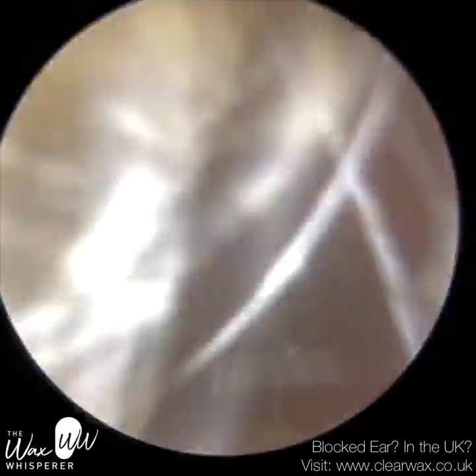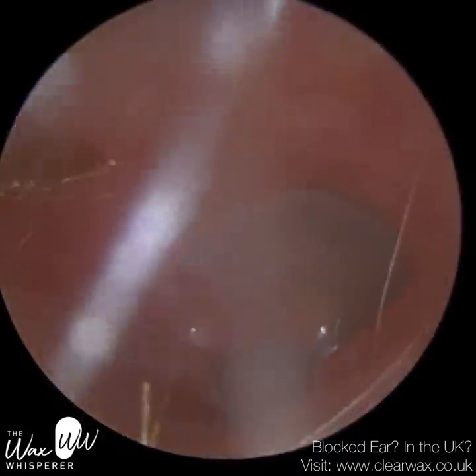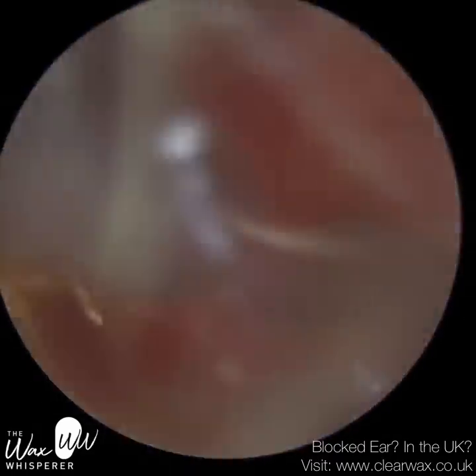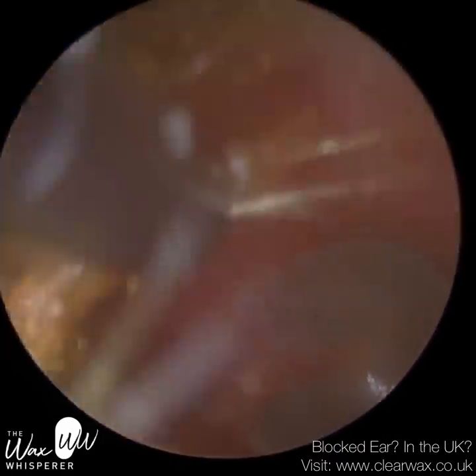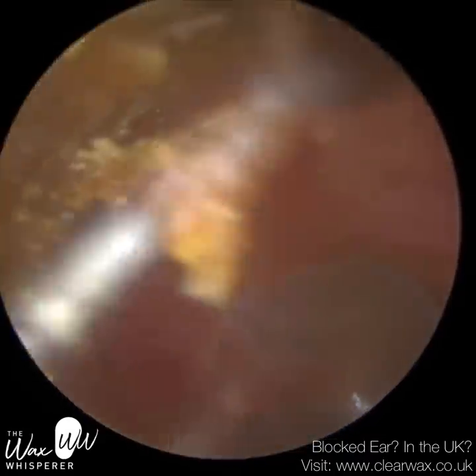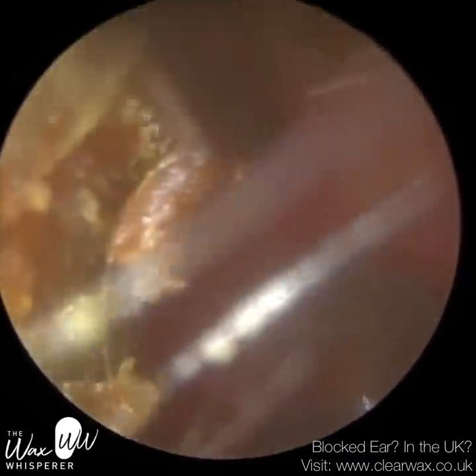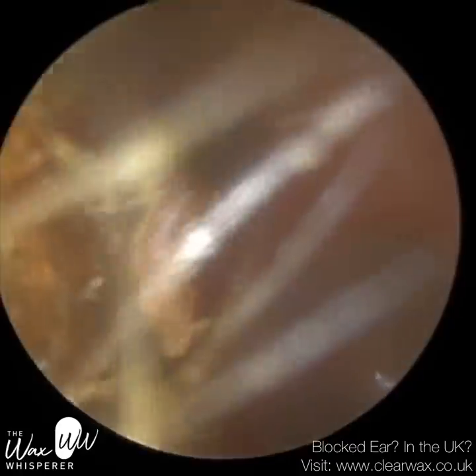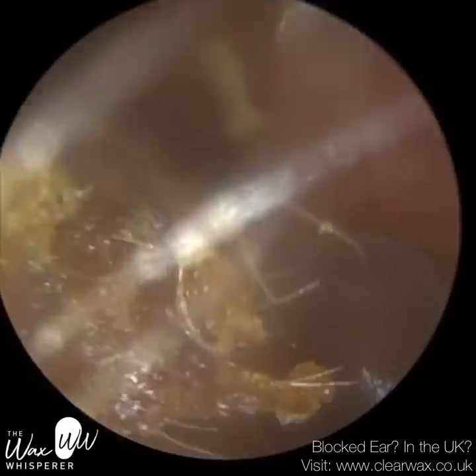It takes around 10 months, give or take — everyone's a bit different — for it to migrate. You can see the eardrum in the distance; it looks nice and healthy. They've got a bumpy floor of the ear canal — you may have seen there's a bit of a divot there. Potentially that could be part of the reason why the patient is getting a build-up of dead skin and wax, because the skin's not able to fully migrate because of that bump, that interference in the road, if you like.